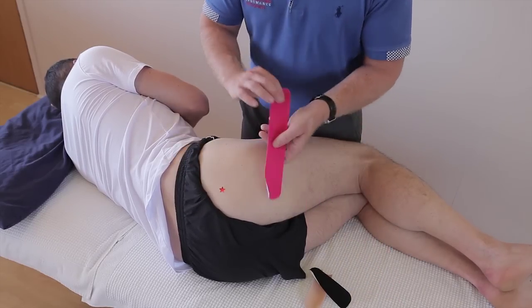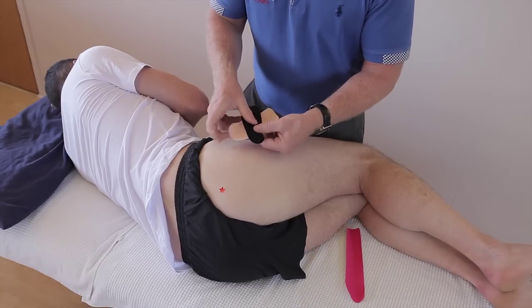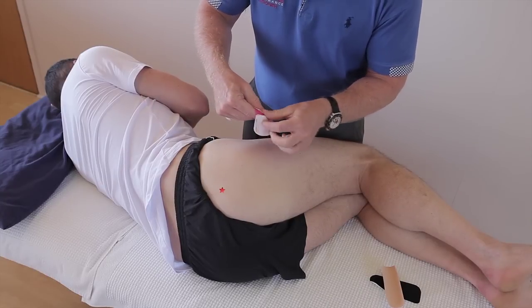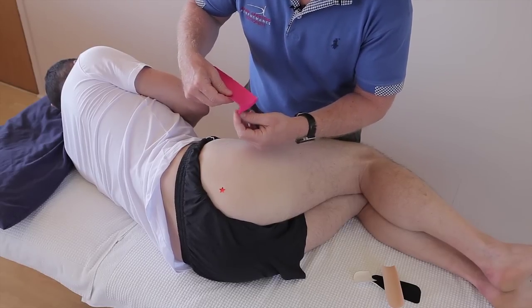The tape I'm going to be using is a standard I-strip and then two smaller strips to be formed into an X. First of all, we're going to split the back of the tape and then apply it.